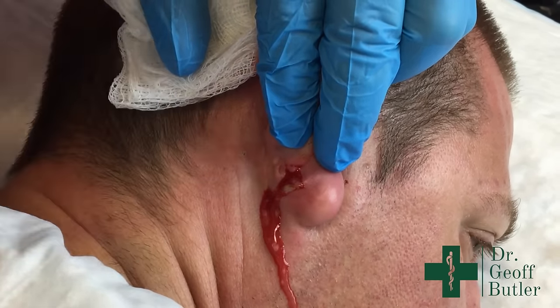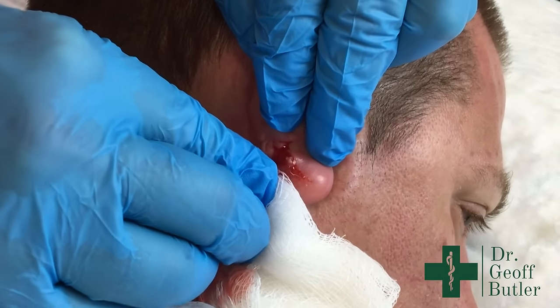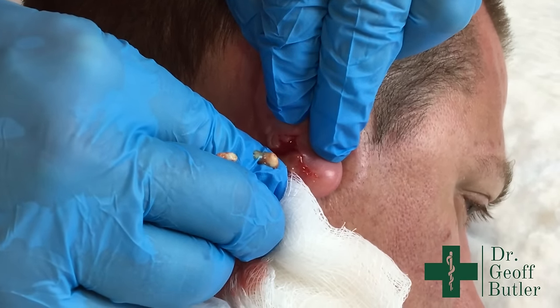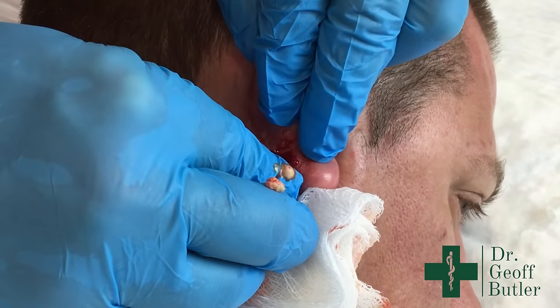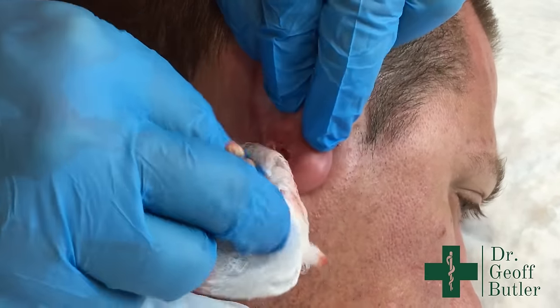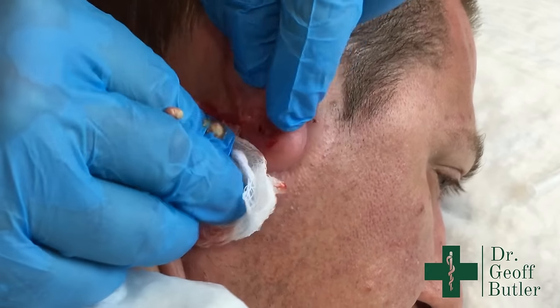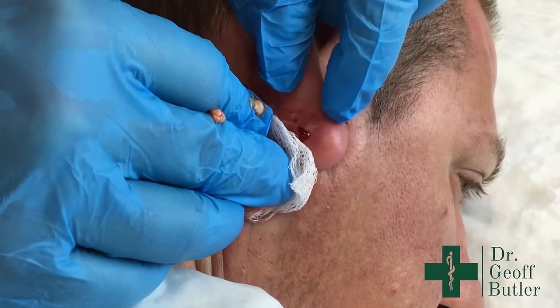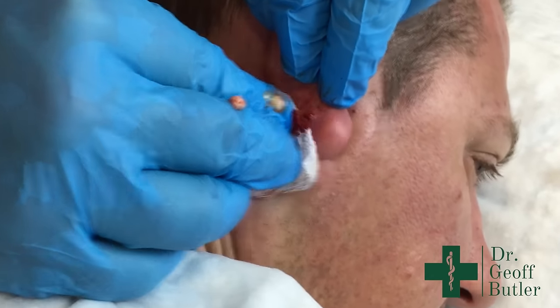You can see that drainage starts to come out. There's some component of keratin there, which would lend away from this being a pure abscess. Remember, an abscess doesn't have a capsule — it's just white cells — as opposed to when you start seeing the thicker material, which indicates there's a cyst present.